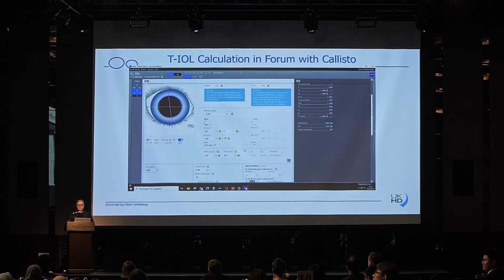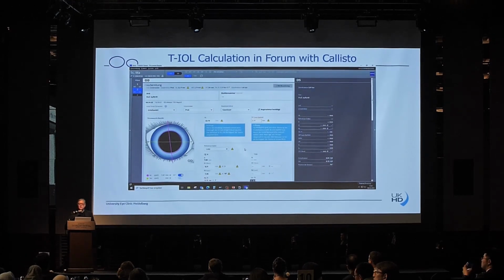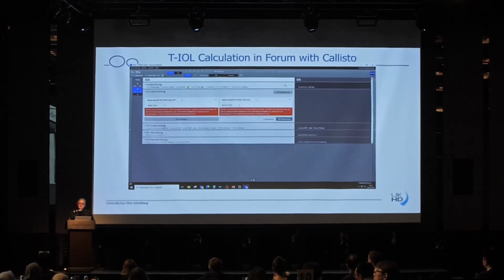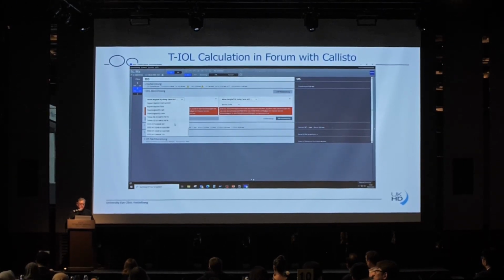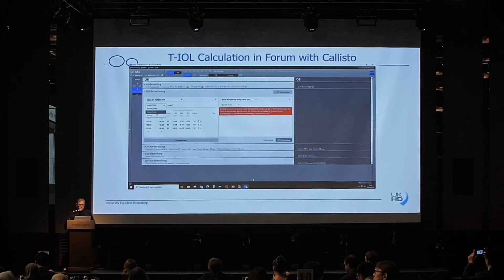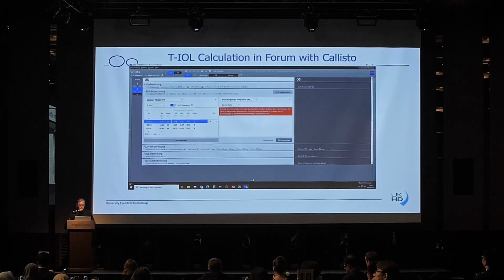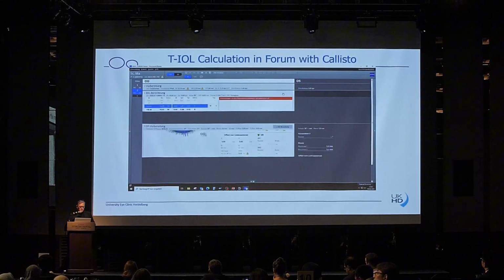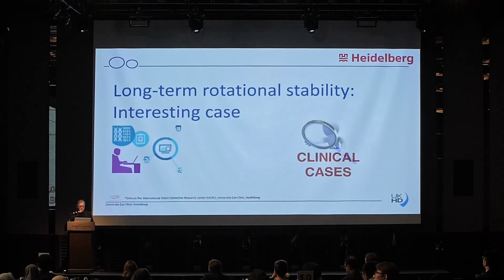And frankly speaking, 20 years ago, we didn't really do clear lens extraction with multifocal toric lenses in younger patients. This is something that we do more or less the last couple of years, and there we really need a very high amount of accuracy. And it's pretty easy to do and self-explaining how you walk yourself through the setup on the screen to calculate the lens. And as you have seen here, I think we can skip that now.